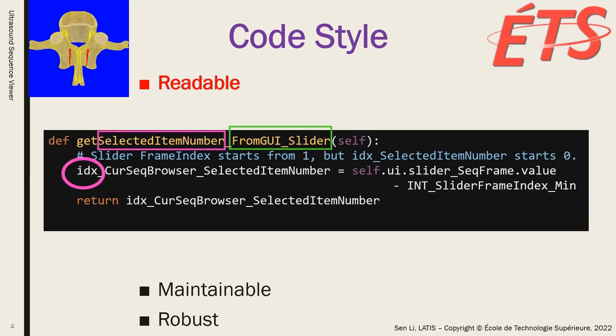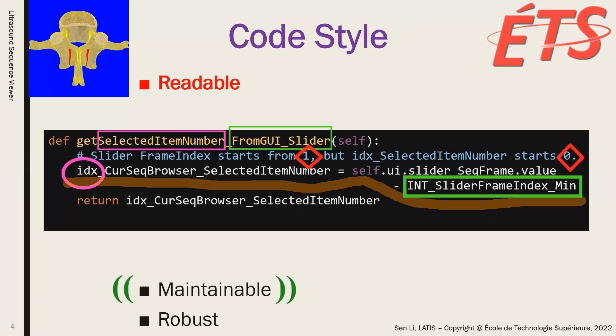From the comment, we know that this function is to make the code maintainable by using a function to avoid the magic number 1, which is replaced by the string macro int slider frame index minimum. The name of the string macro begins with the type int, and it contains two more phrases, meaning the minimum of the slider frame index.